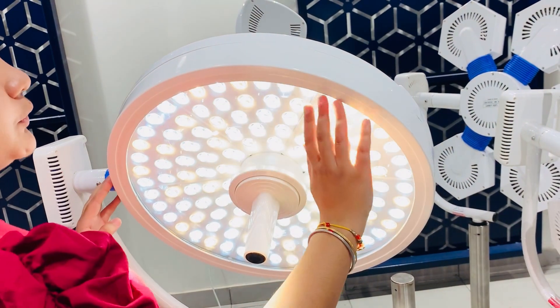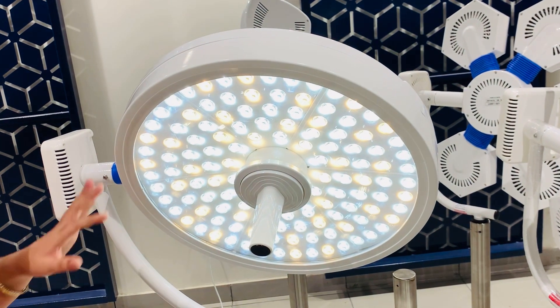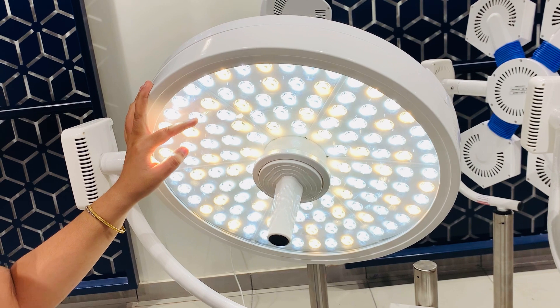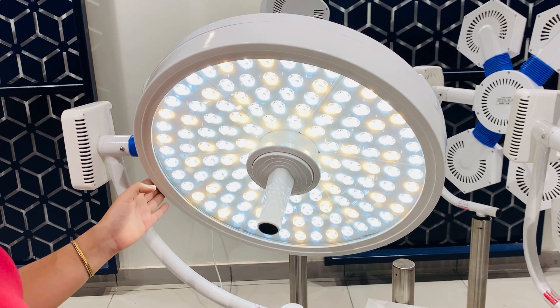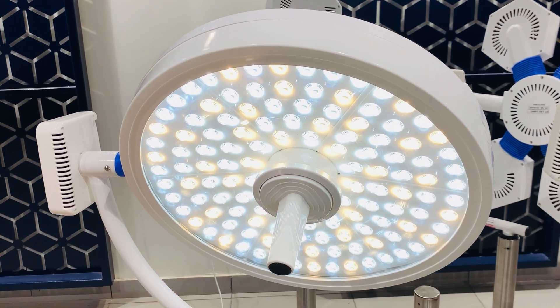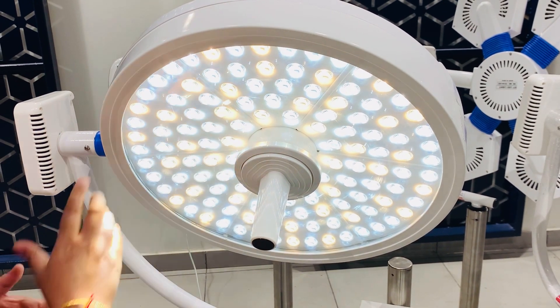In this light, we have used high-quality ESD safety glass that will make the LED scratch-proof, fast to disinfect, and protect it from UV and IR rays. The total number of LEDs in the dome are 126 and the total intensity of the light is 160,000 lux. We have used yellow and white LEDs in this light.